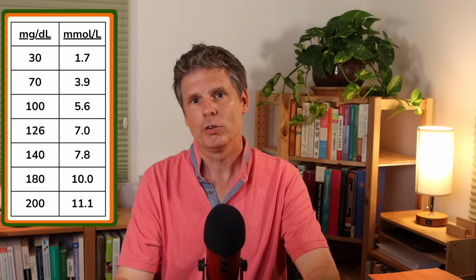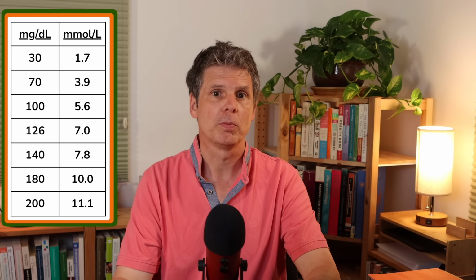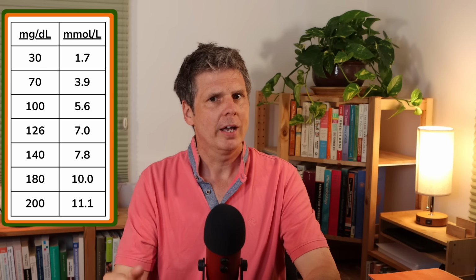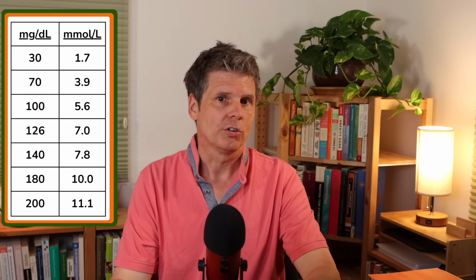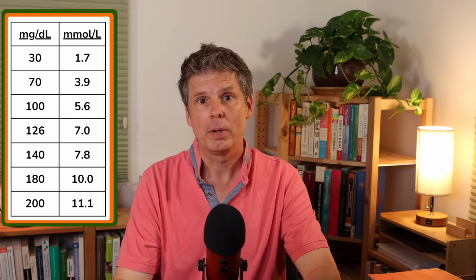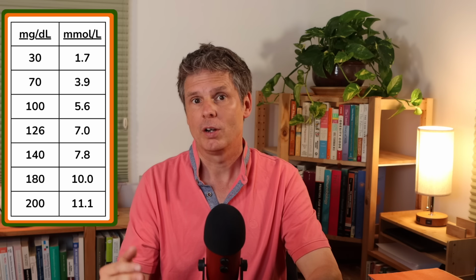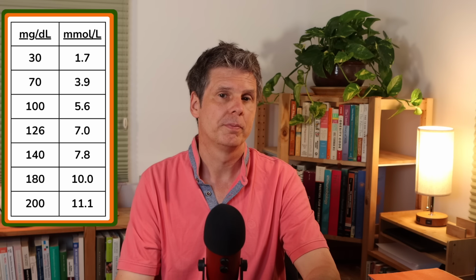Now, if you have not been told that you have diabetes or prediabetes, you may still have one or the other because the number of undiagnosed people with these conditions is thought to be very high in most countries. In that case, you can use your CGM data to get a sense of whether you should see a doctor for some more testing. Note that you cannot use your CGM to diagnose any condition because the diagnostic criteria are all based on standardized lab testing. But you can get a pretty solid idea of whether your blood sugar levels are normal or not and whether any follow-up with a professional is warranted.